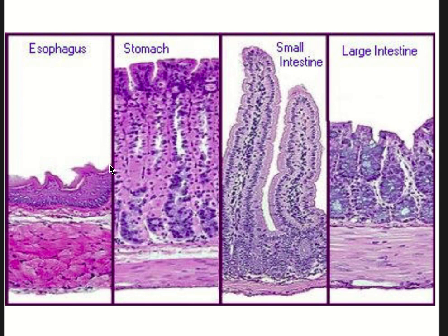So here's a good side-by-side view of your esophagus, which you can tell by your stratified squamous. Now, one thing I think you can get mixed up on if you're not careful is the stomach versus large intestine. So don't go simply off the fact that you see flat tops, because that's not enough. Both of these have them in different parts. Like the fundic region is going to have a lot of flat tops. But I want you to see rather, do you see an oblique layer of smooth muscle in your muscularis externa? You can tell these are going to be gastric pits, right?